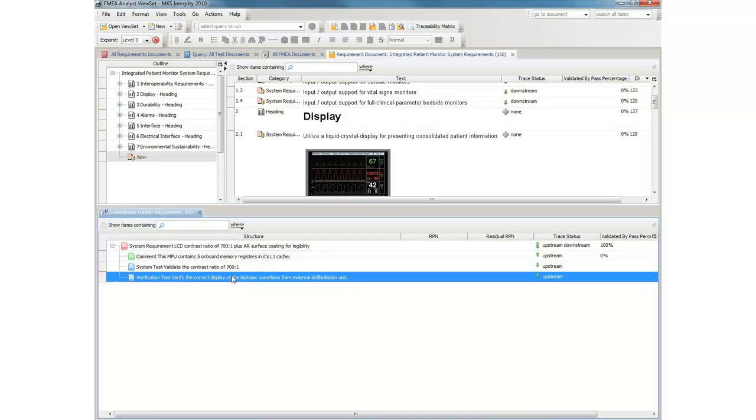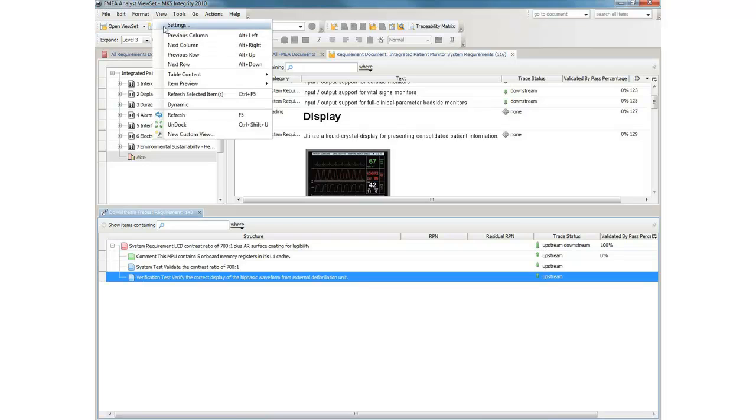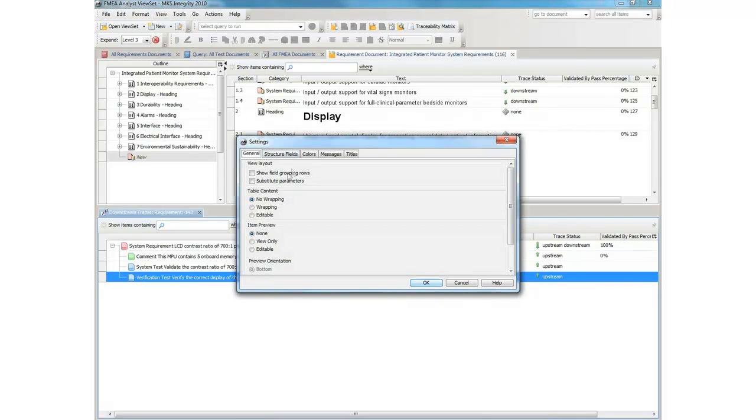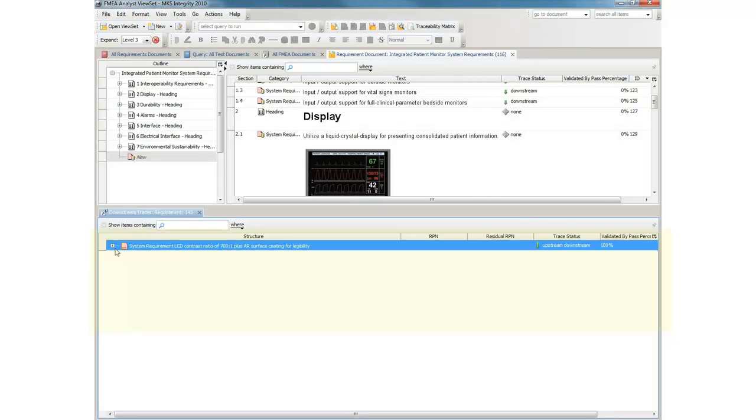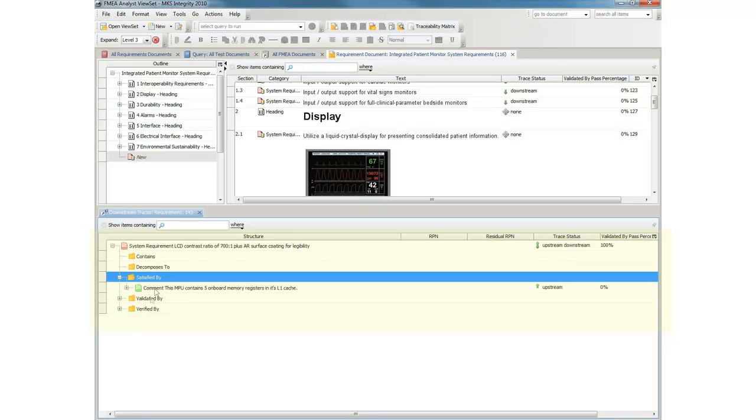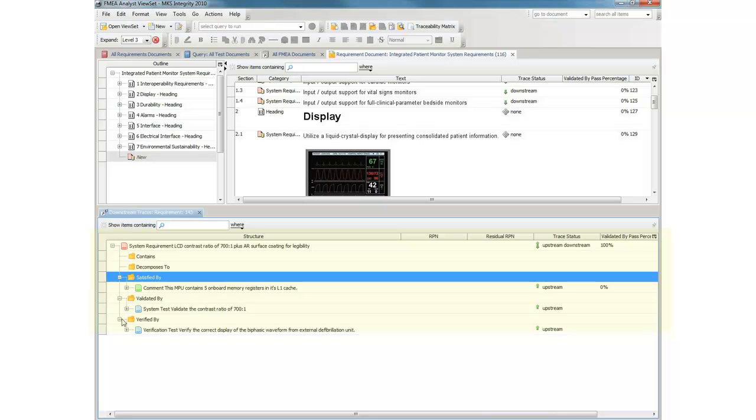These traces are created through the MKS Integrity concept of defined named relationships. Here we can examine these traces based on the nature of their relationship to the originating requirement. The specification satisfies the requirement, and relevant test cases are also related.